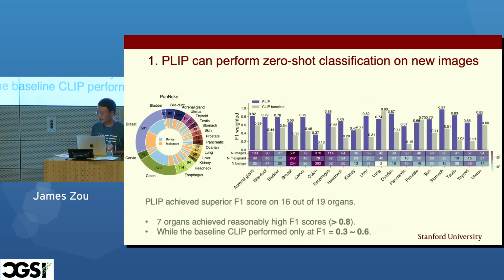And we did a lot of additional evaluations here. The previous result looks at the aggregate across all the different tissues, but here you can also break it down by different organs and tissue types. This shows that even if you look at more granular tissues, the PLIP model's classification performance is pretty consistently higher than the OpenAI models that have been trained on more natural images. I think this also demonstrates the benefit of leveraging the Twitter data, because it is very heterogeneous and diverse. It comes from all these different tissues and organs. This helps the model generalize better to different subtypes.